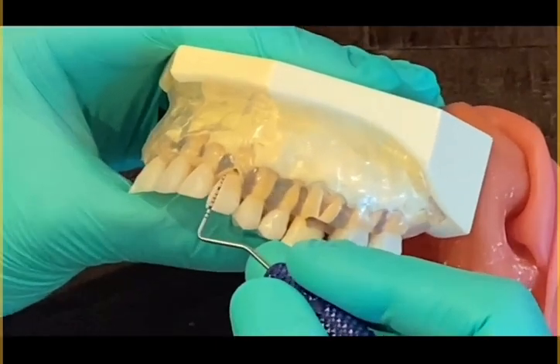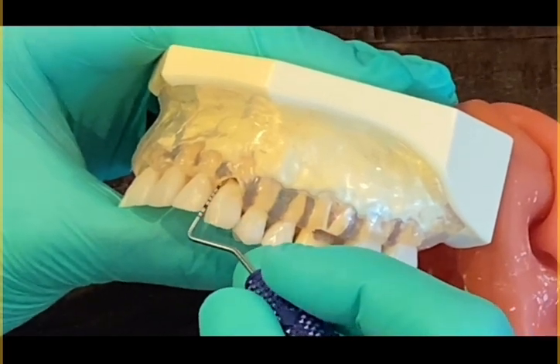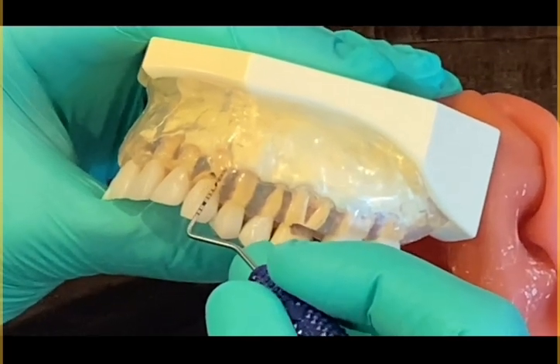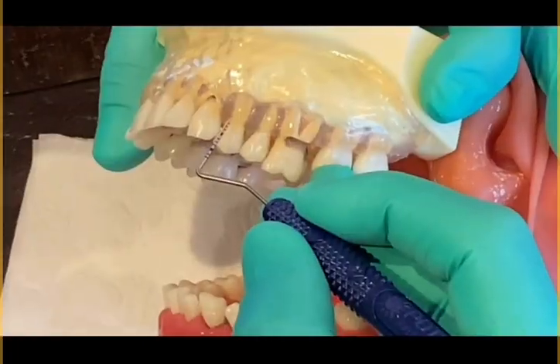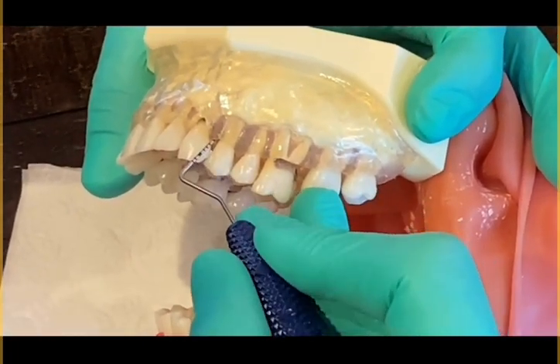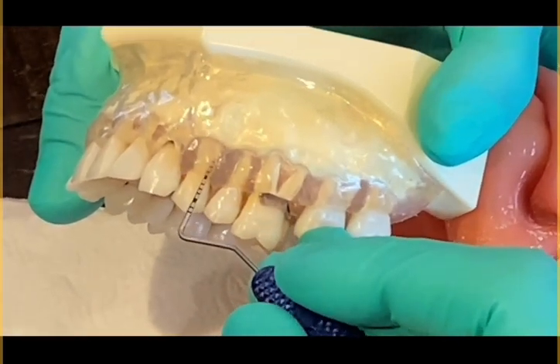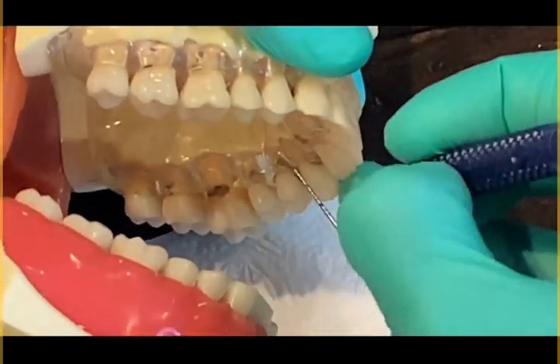So we're on number 11 here. 4. 4. 6. On to number 12, same thing. 5. 4. 6. Then I will do the rest of these teeth, coming around on the lingual to number 12.